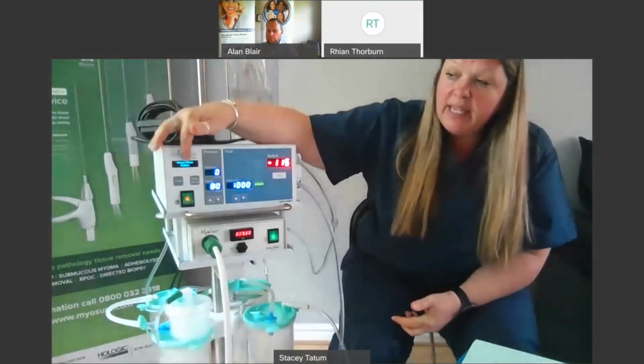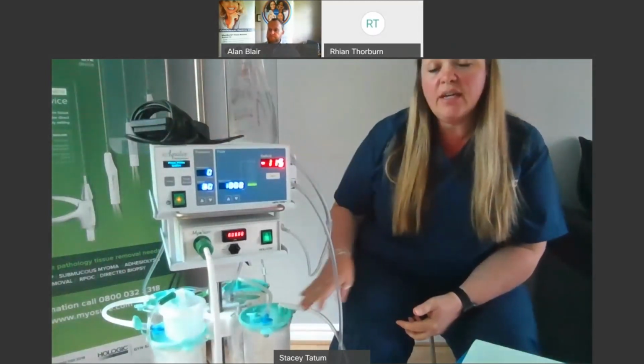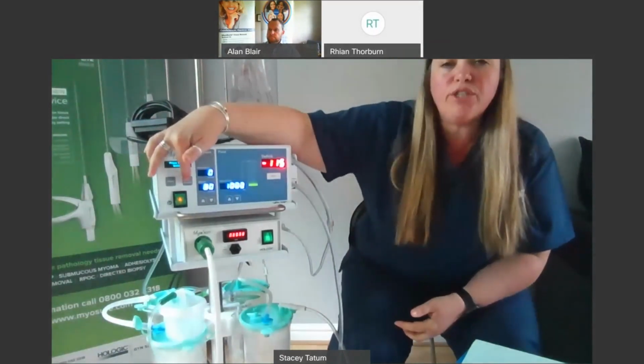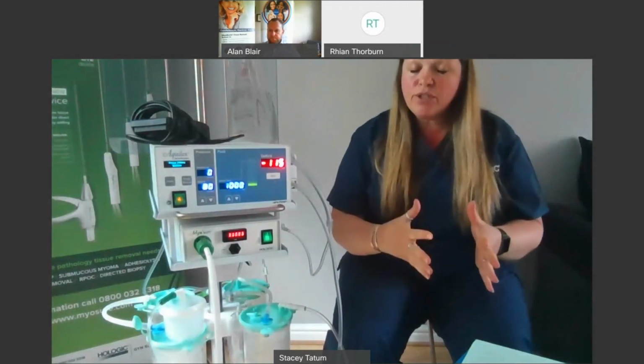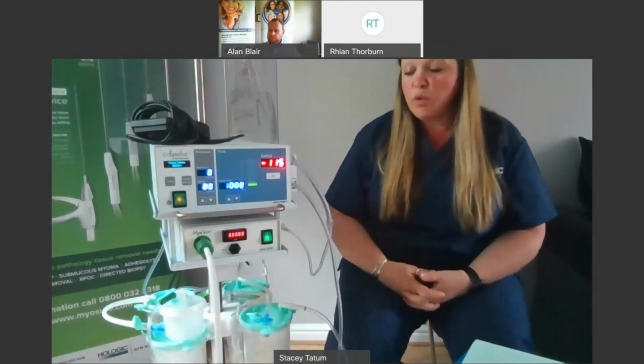Also, what you might see is it might go into pause mode if you tap the canister by accident. If that's the case, just press pause and resume again. And again, if you need to change a canister, just let your surgeon know what you're about to do, because as soon as you touch a canister, it's going to pause.